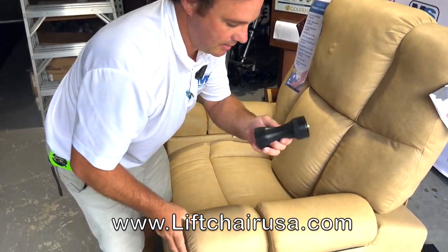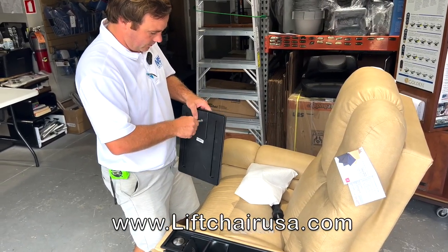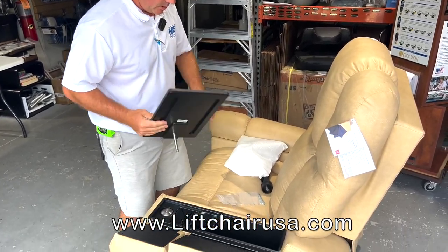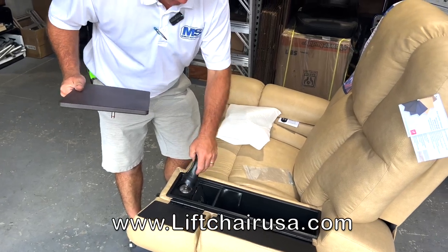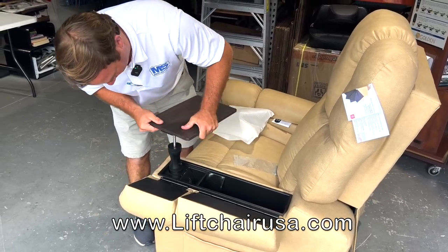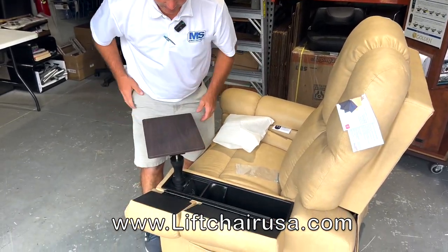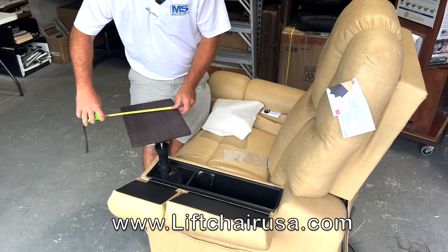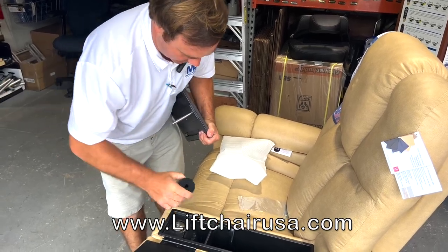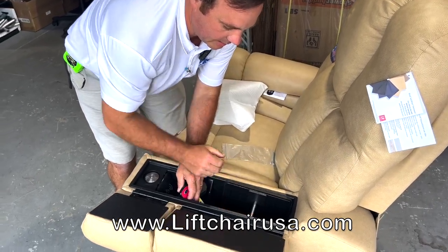All right, this is for your tray. This came in a little box. This is where your tray goes. It doesn't always stay there. And you can tighten it down with that if you need it. This is gonna let the tray sit up higher. It's not big. 13 by 9, but it still works. And then when you're not using it, just take this off, put it here, stick this down into your bin.